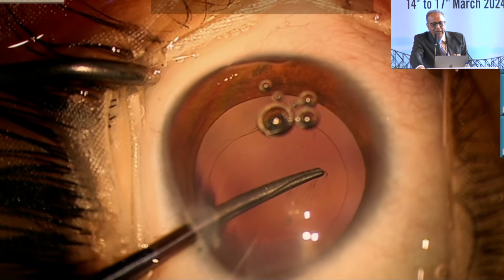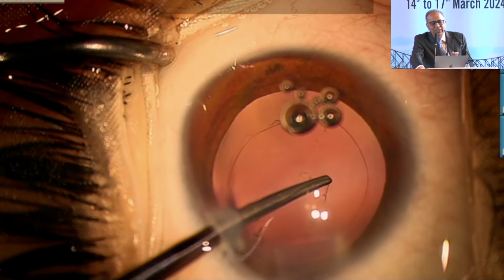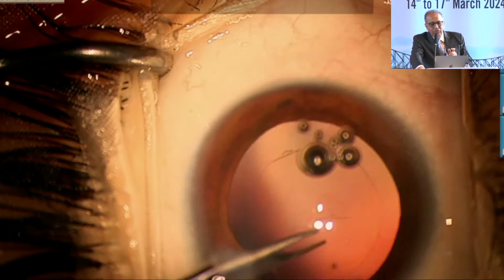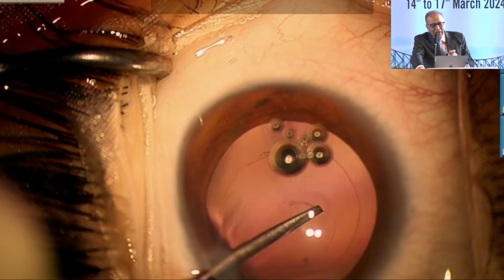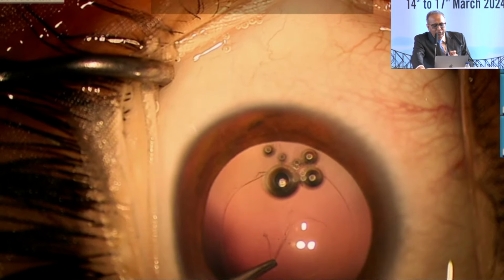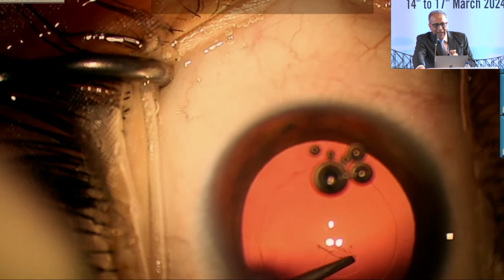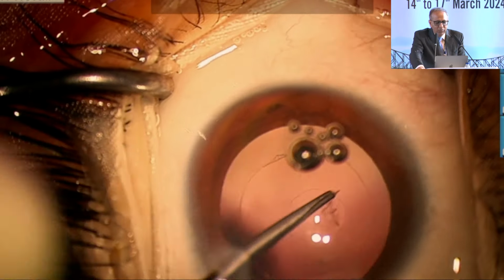It's the initial hiccup which we have. Stable chamber settings, posterior capsule not that deep, because if it is deep enough, you will create a situation where you will find it difficult to hold. And the second part is that the chamber settings should be stable. So I always use micro forceps through a calibrated incision so that there is no undue efflux, no undue instability of the chamber, and you will find that the posterior capsular rhexis has been adequately completed. So this is how you can complete it at times.